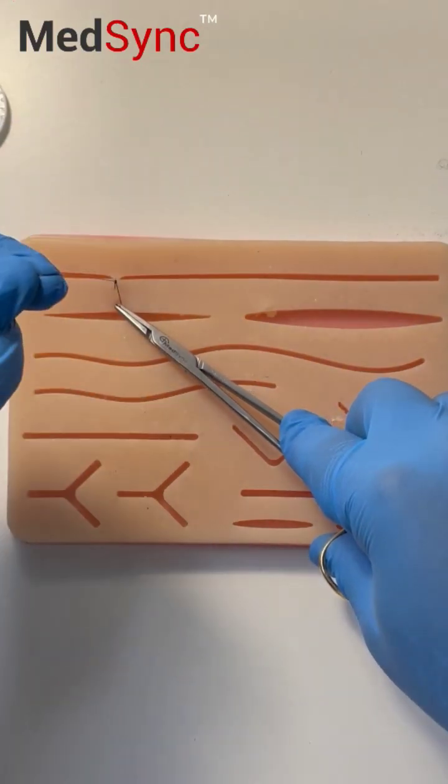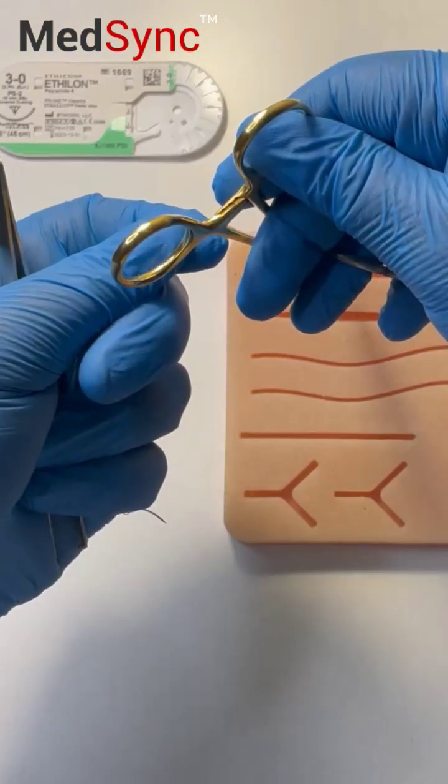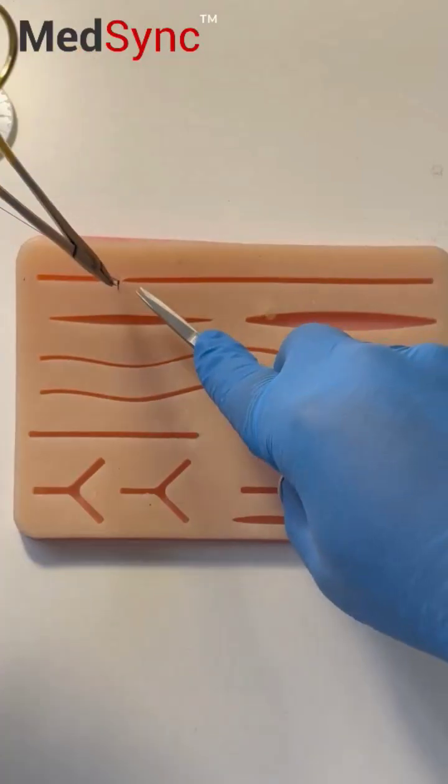Put everything into your left hand. Long suture in my left. Needle holder in my left. Put your finger into the ring. Put your thumb in.